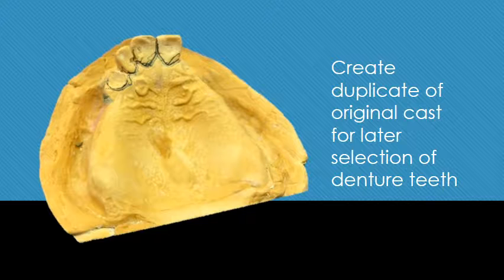Also, you'll notice that we have the well-healed posterior ridges, which are a result of previous surgery, and it presents an ideal case.